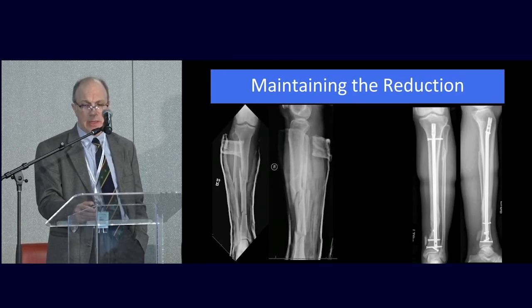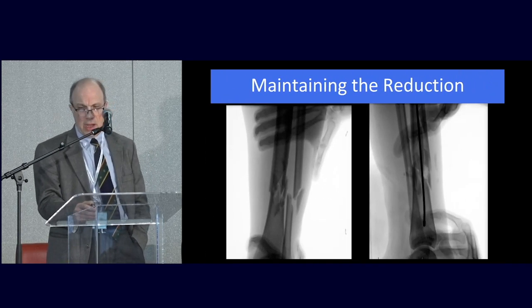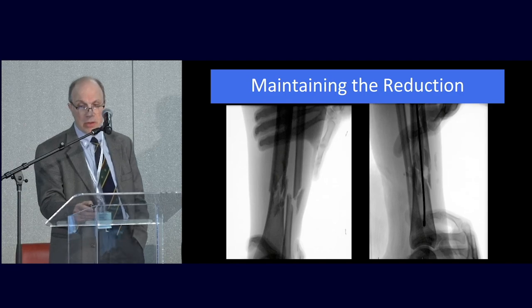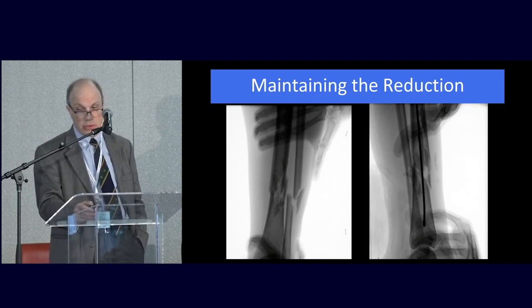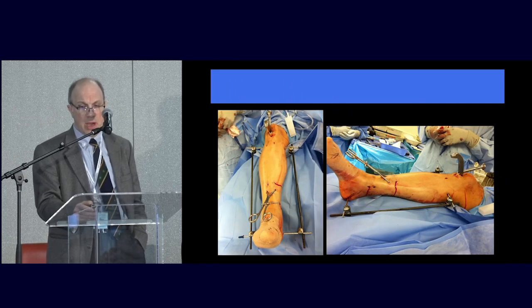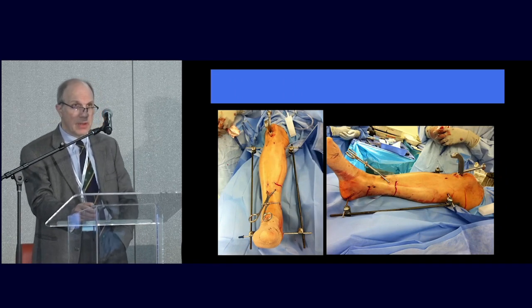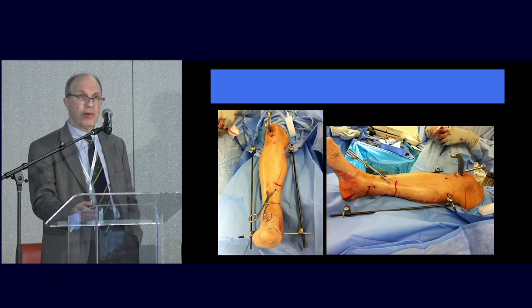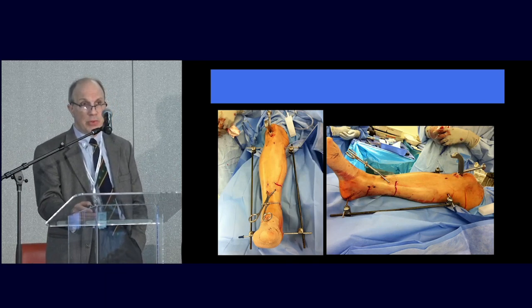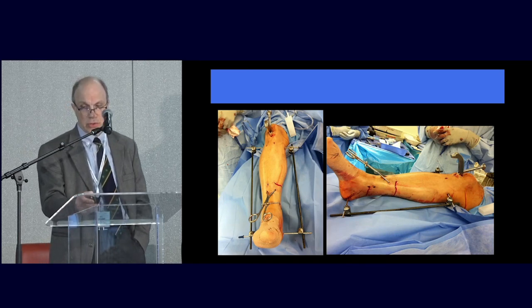Again, to maintain the reduction, I'm going to reiterate how we get from this to this. You can hold the leg, or somebody can hold the leg, but there's a lot of radiation going on, and still a lot of struggle, like continuously holding something. I commonly use this traveling traction setup for almost all of the tibia fractures, although I have trainees who can hold it, even in the semi-extended position. In more distal and proximal fractures, I think it's very useful.